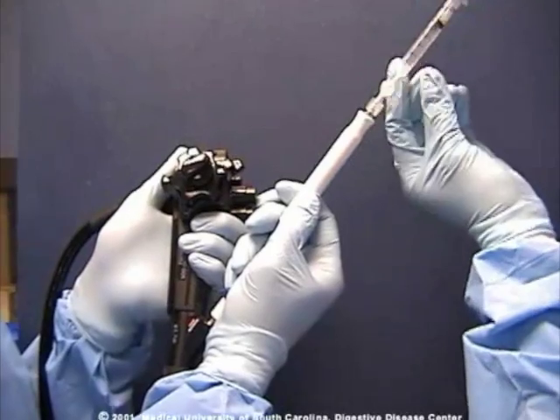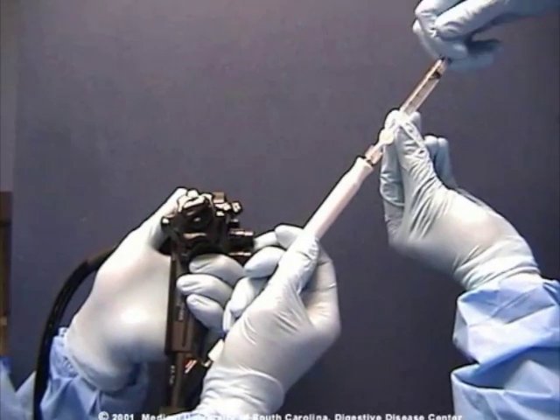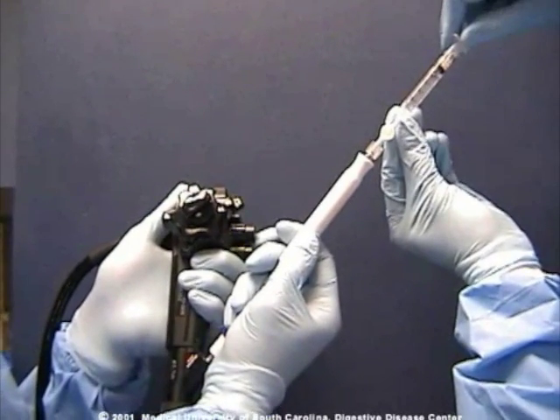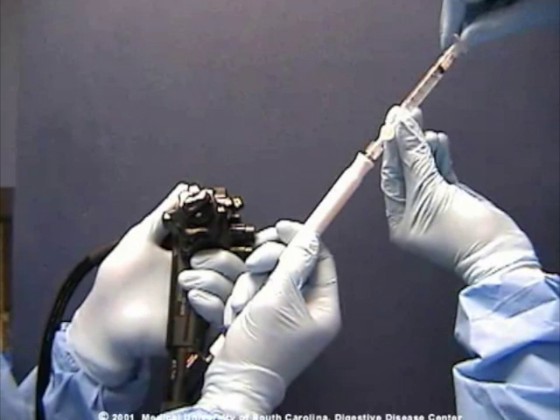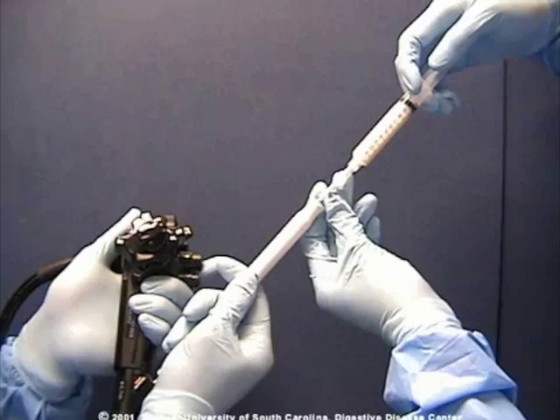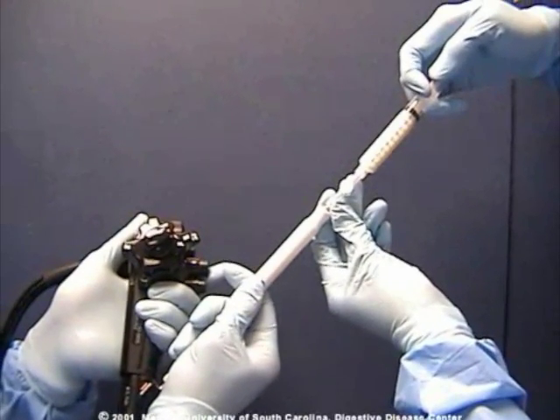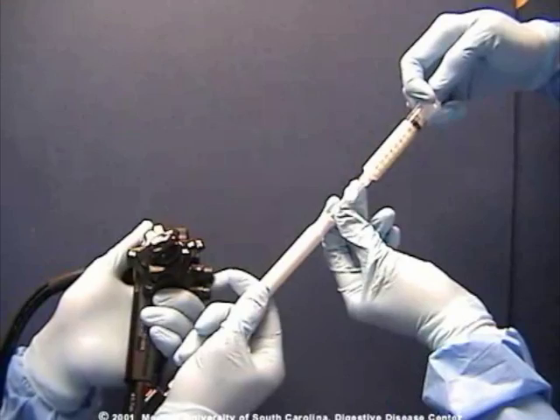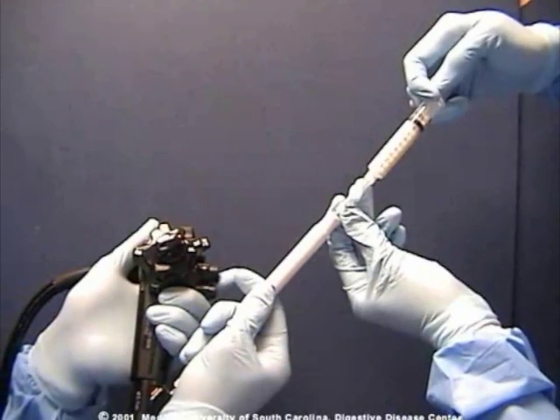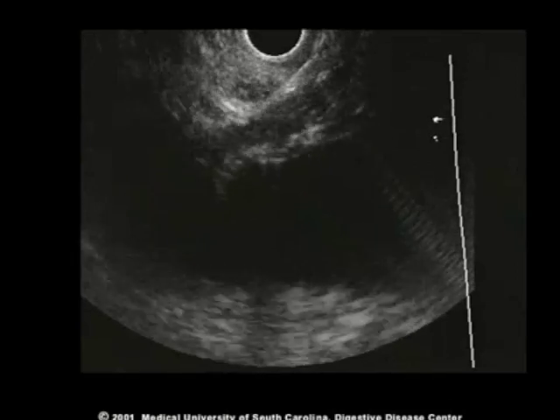Prior to injection, a test syringe is attached and suction is held for 10 seconds to make sure there is no blood flashback. We then perform a test injection of normal saline, followed by the injection of the anesthetic agent — in this case a mixture of bupivacaine and triamcinolone.